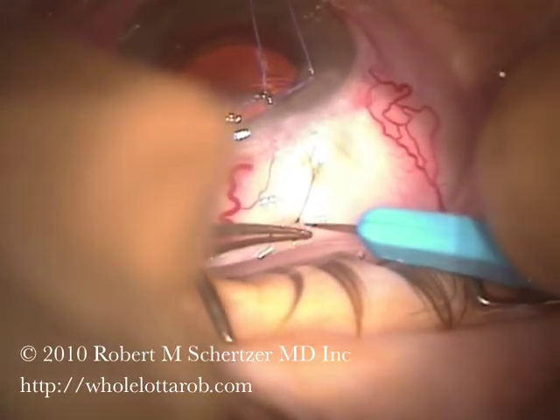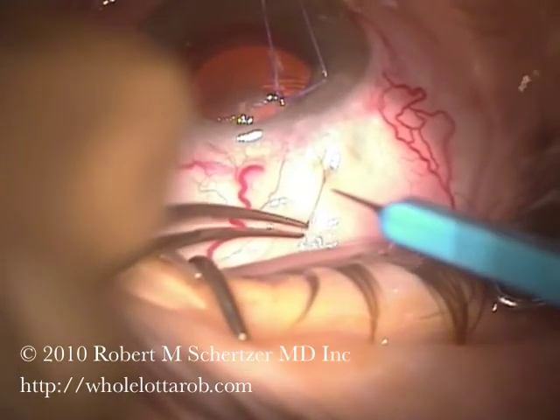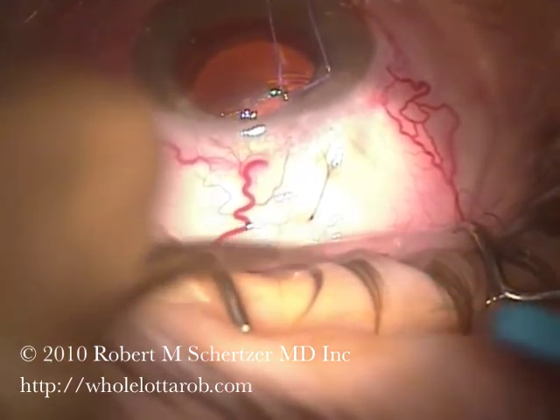So this can work very well. You have to be really careful, though — if the bleb is completely avascular, then you could just end up tearing it. But in this case, it seems to be working fine at least a few weeks out now.